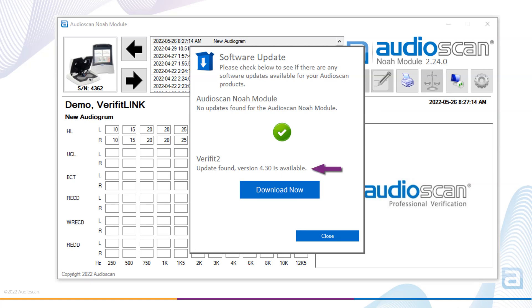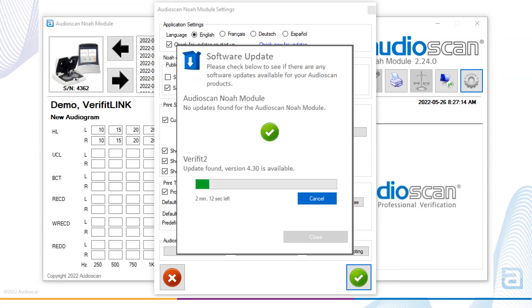If a software update is available, a download now button initiates a download of the software from the internet. The download process should be brief. One to two minutes is typical.